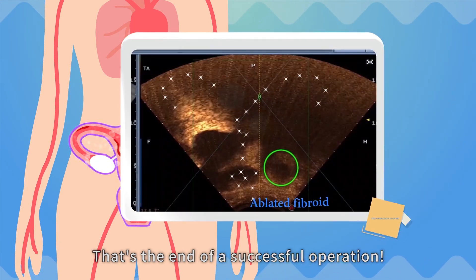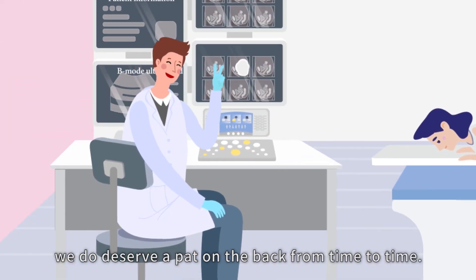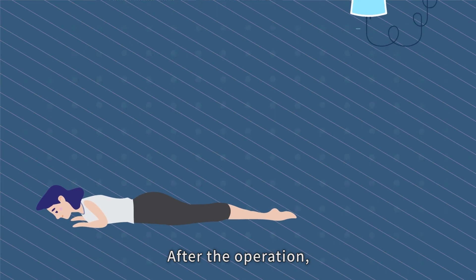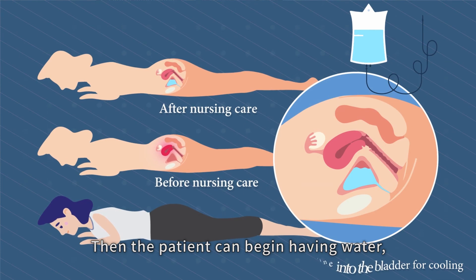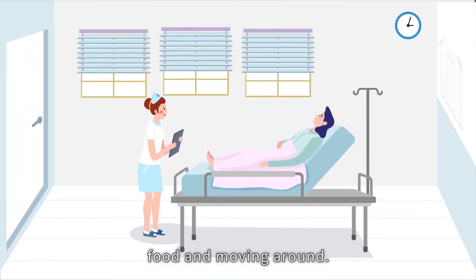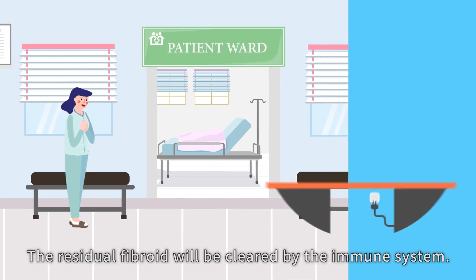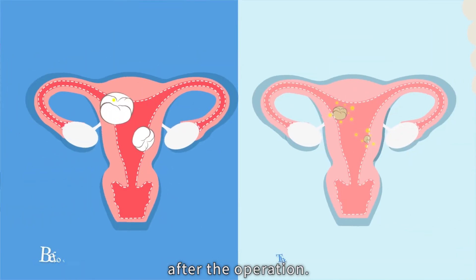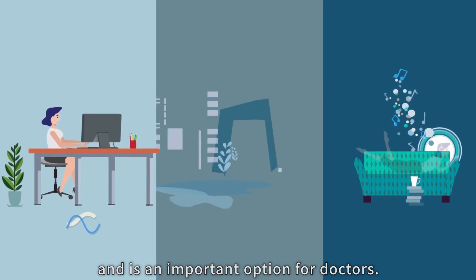That's the end of a successful operation. Isn't it easy and lovely without all the tiring procedures? After the operation, nurse the uterus for two hours by cooling it down. Then the patient can begin having water, food and moving around. She will be able to return to work in three days. The residual fibroid will be cleared by the immune system, and the patient will be able to get pregnant three months after the operation. The HIFU knife means hope for patients and is an important option for doctors.